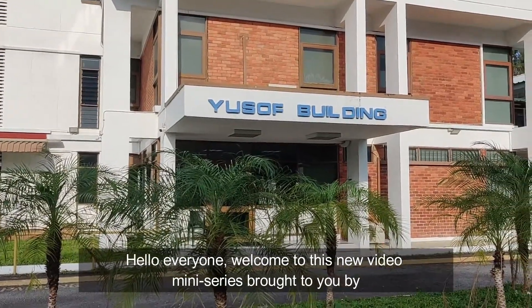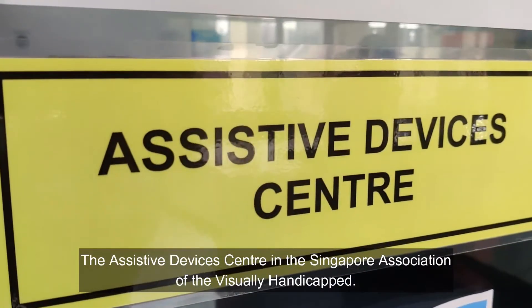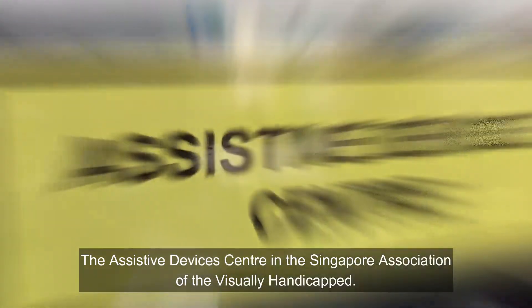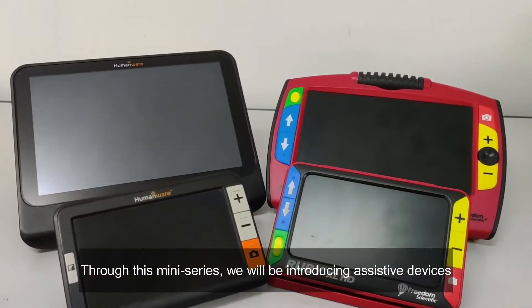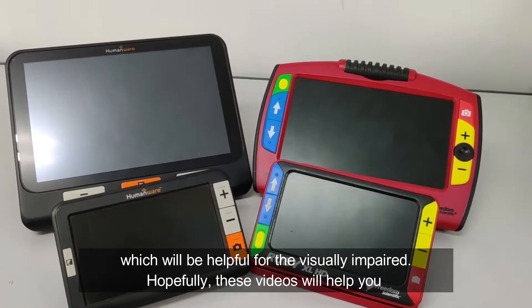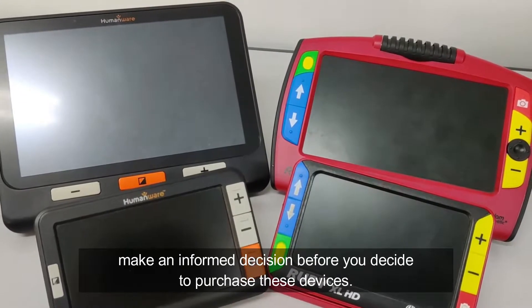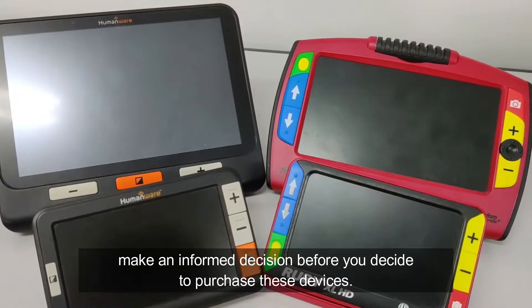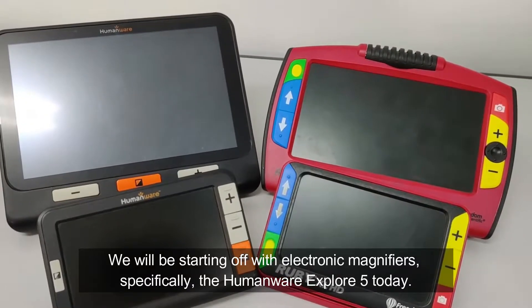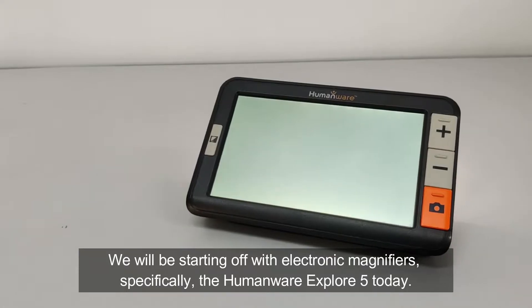Hello everyone, welcome to this new video mini-series brought to you by the Assistive Devices Centre in the Singapore Association of the Visually Handicapped. Through this mini-series, we will be introducing assistive devices which will be helpful for the visually impaired. Hopefully, these videos will help you make an informed decision before you decide to purchase these devices. We will be starting off with electronic magnifiers, specifically the Humanware Explore 5 today.